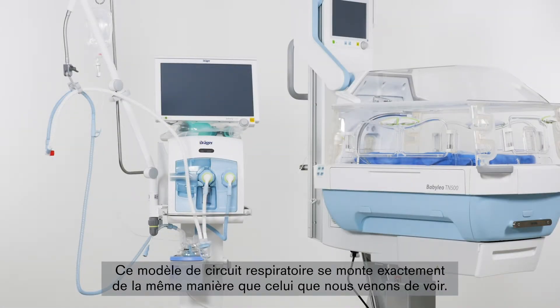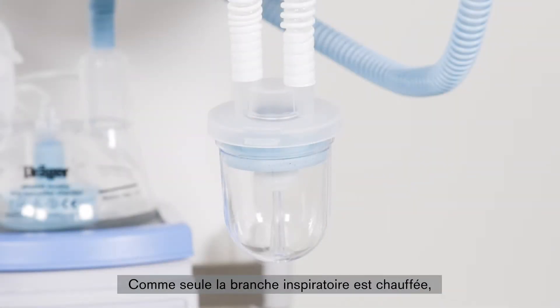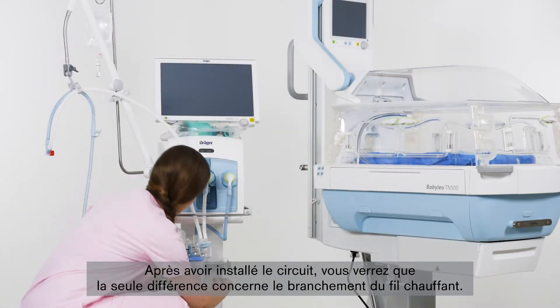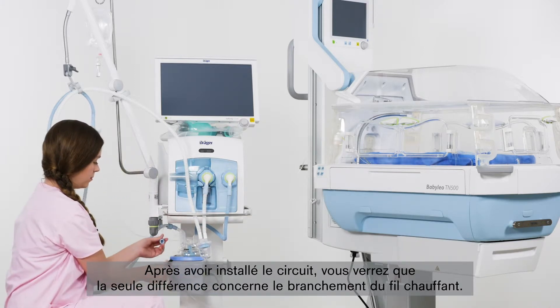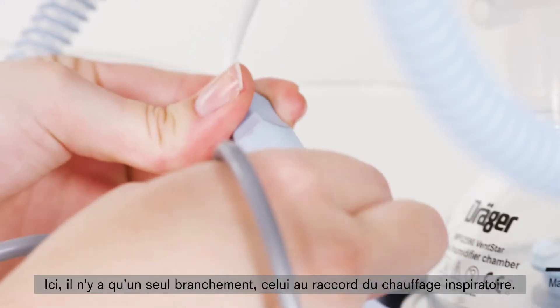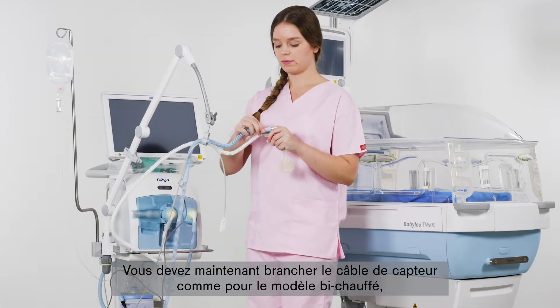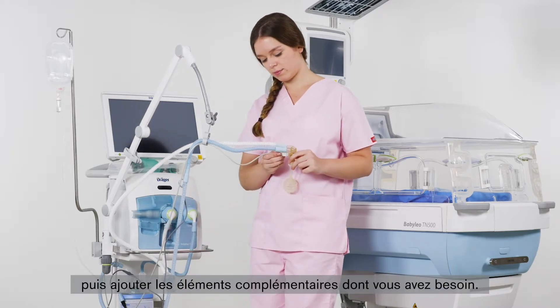This breathing system is basically set up in exactly the same way as the previous product. Since only the inspiratory limb is heated here, the unheated expiration limb contains a water trap, which will be explained in more detail later. After setting up the system, you will notice that the only difference lies in the connection of the heating cable — here there is only one connection to the inspiratory heating connector. You should now connect the sensor cable as previously demonstrated for the dual-heated system and add further components to the system as required.